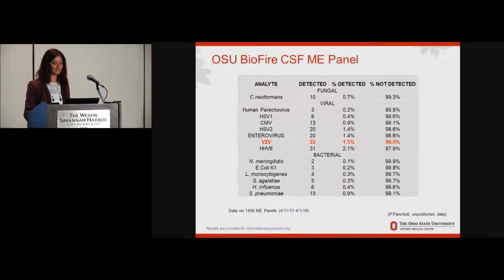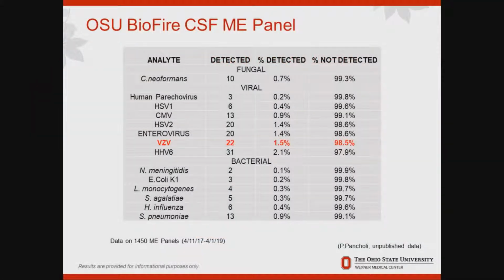Now, as I mentioned, in my institution, we sort of have a mix of different assays. We offer singleplex assays for VZV, HSV, but then we also offer this multiplex assay, which is the OSU BioFire CSF ME panel. So what I wanted to do was just sort of give you a little bit of an introduction to this assay and how many positives we see with this multiplex assay.